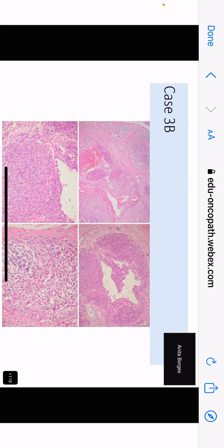Who said epithelioid hemangioma? Ma'am, I said. Who's the I? Ma'am, Dia. Dia, and hemangioma is a tumor of what? Blood cell? Vessels. Don't say of blood vessels. Endothelial cell. Endothelial cells. So you see spaces lined by endothelial cells?